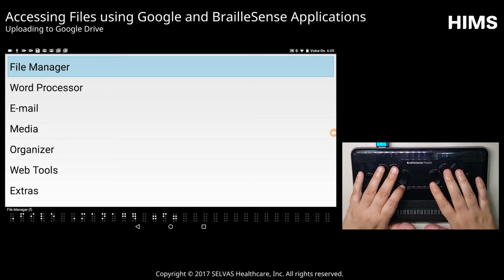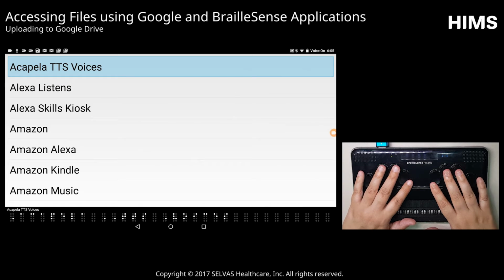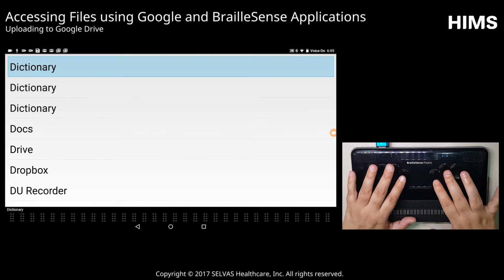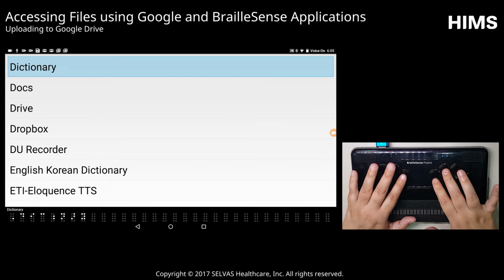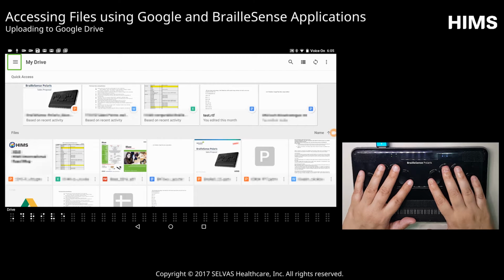I'm in my main menu, so I'll press A for all apps. And I'll press D several times to open Drive. And I'll press Enter. Using account hims.jenny@gmail.com. And my opening screen here shows my recent files and several menu options.